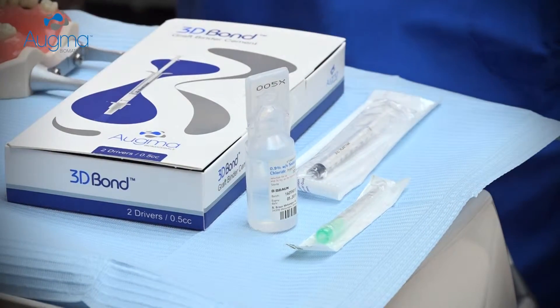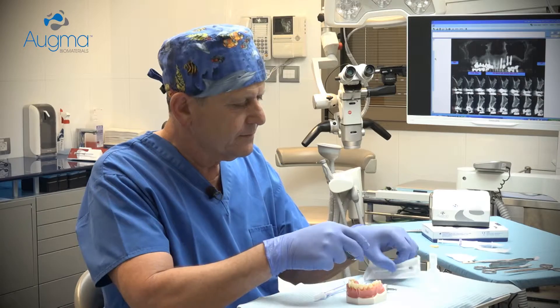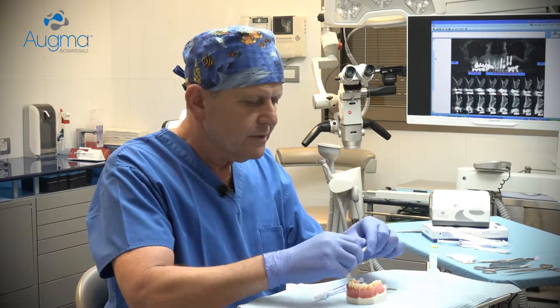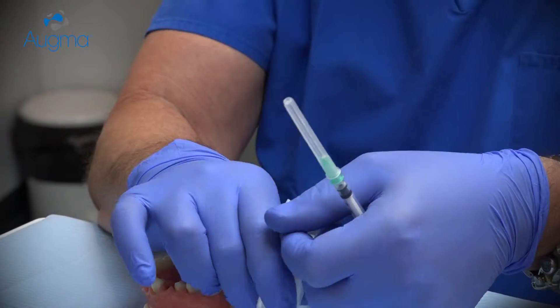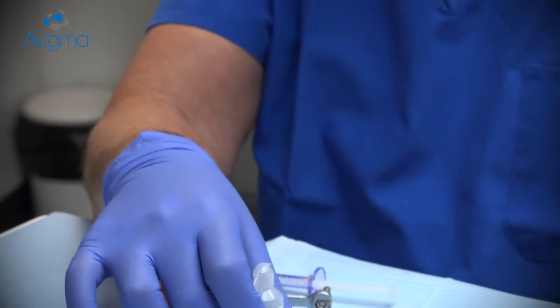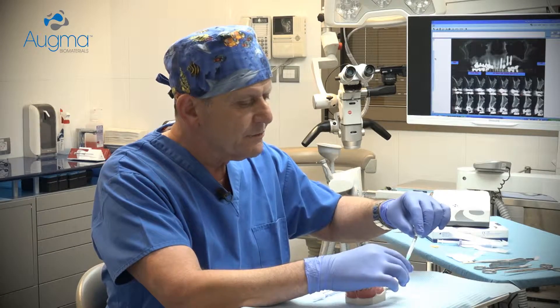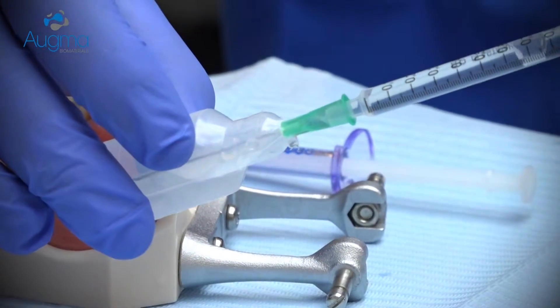Let's get started. First, fill the activating syringe with sterile saline from the vial. Make sure that the syringe is entirely filled with the saline.